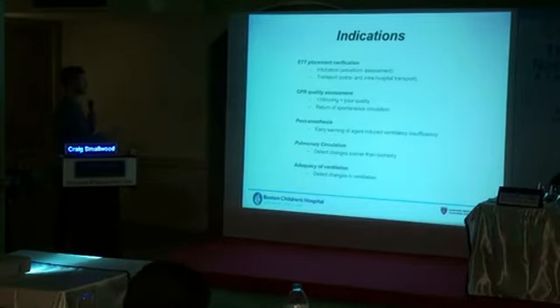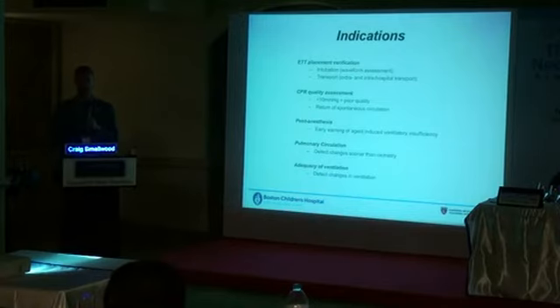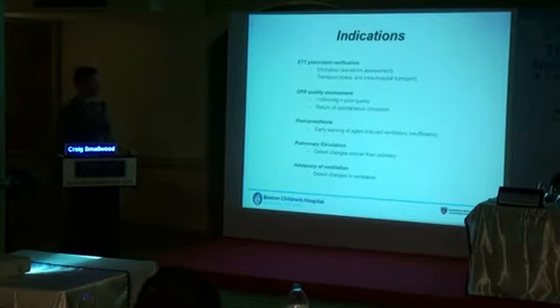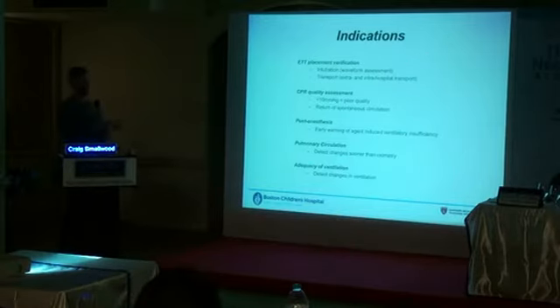So endotracheal tube placement, obviously intubation. One of the things we do as standard of care, I don't know what your practice is, but any infant or child or anybody who gets intubated or in the ICUs, we will have an end-tidal CO2 device ready and warmed up, because sometimes they can take a little bit to fire up. As soon as that endotracheal tube is placed within the airway of the patient, we affix that device and look at the waveform. So what we want to see, and we'll come to this when we look at some illustrations of what it looks like, but you guys know what it looks like. It's just a nice sharp rise in CO2 up to a level that's probably around 30 to 50 or so in that range. Might be a little bit plus or minus, but that's generally our indication.